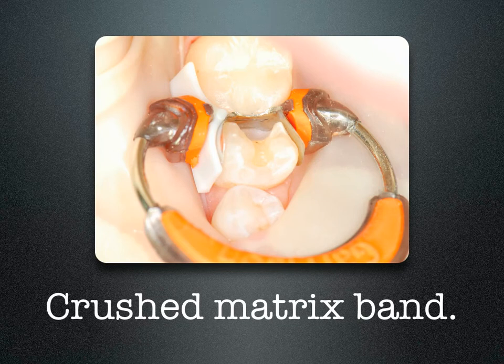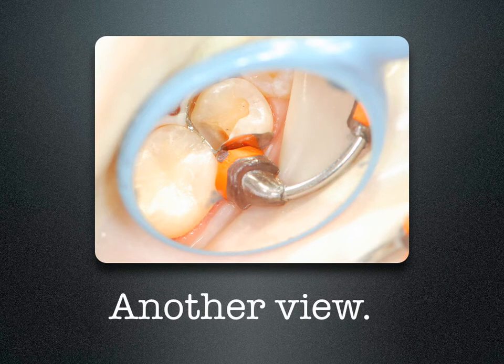I'll show you by demonstration how, by using an ABC wedge on the left side and a separating ring on the right side, how the ABC wedge supports the matrix band, while the separating ring causes the band to take on the shape of the ring itself, crushing the matrix band into the box. The ABC wedge on one side supports the band; on the other side you can see the plunger tip of the separating ring crushing in the matrix band, dictating the shape of the tooth.